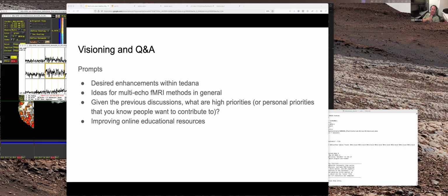If you know you're going to censor time points, that's a lot of variance from head motion that you're trying to fight with using tedana. And similarly for drift, that's a lot of variance just for some smooth curve that you could take out of the data and possibly get more refined computations afterwards.